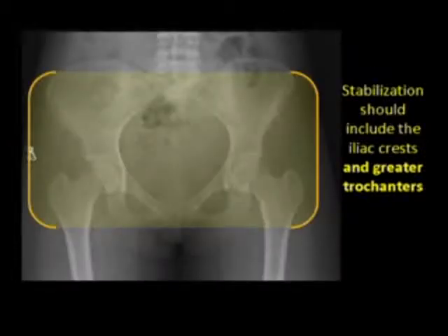Reduction and immobilization of the pelvis is mostly a matter of finding the proper landmarks. Inexperienced providers are more likely to focus their attention on the iliac crests. However, it's important to remember that most of the architecture of the pelvic ring extends well below the patient's waist.